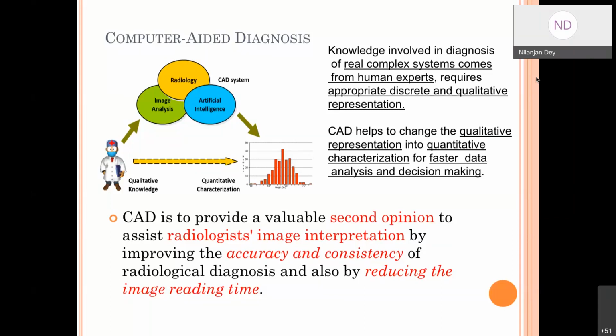And the last one is the quantitative measure. If you have a tumor or a lesion, it tries to quantify it. So there are three different categories of software.